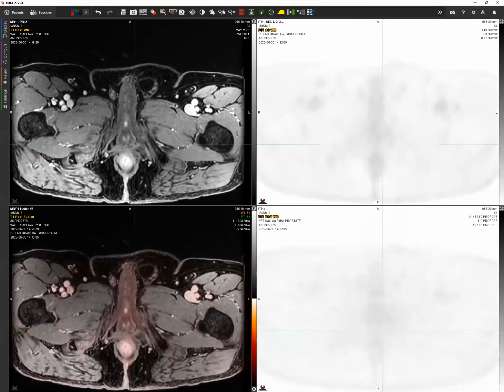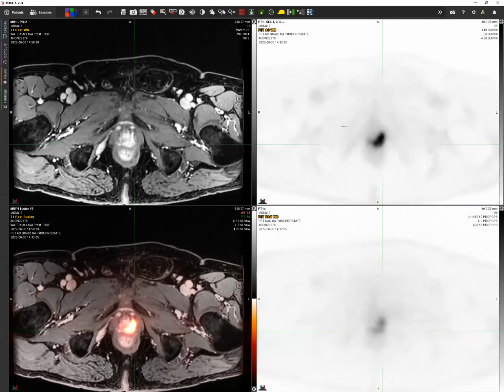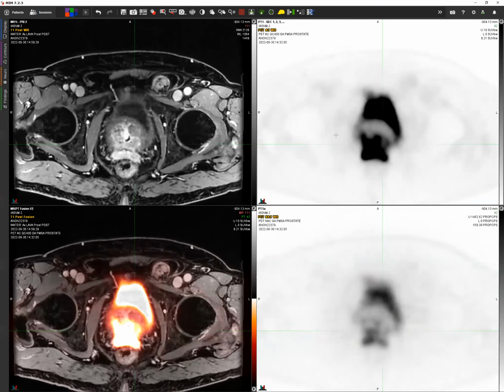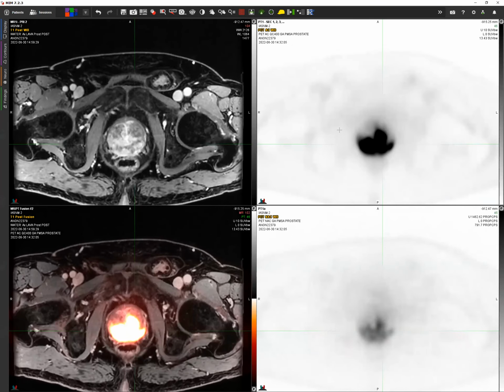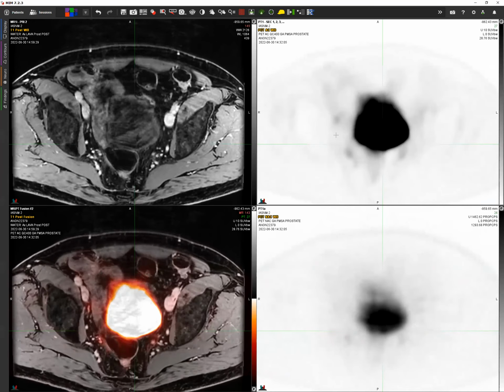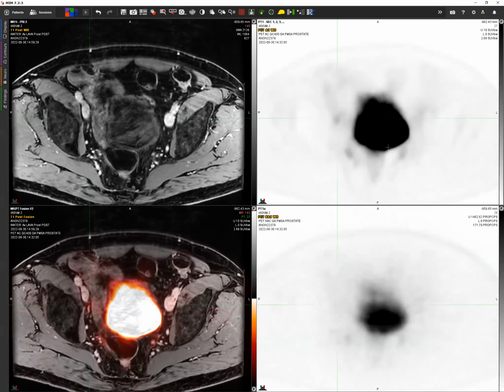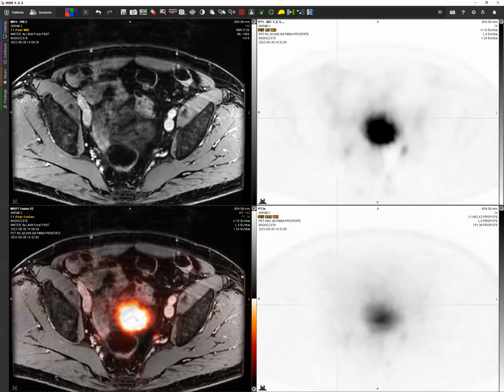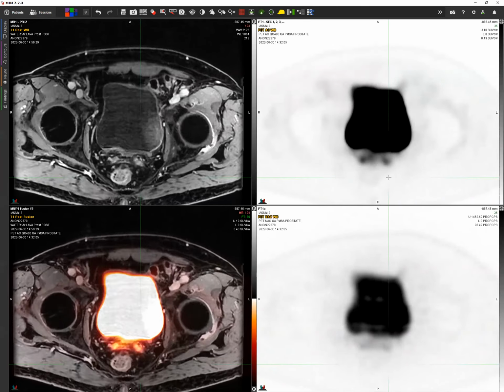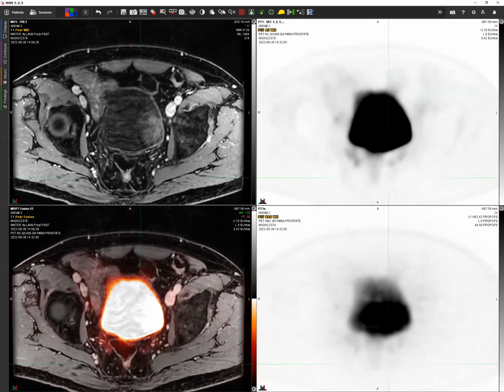Just to give a sample of our image quality at the focused region. So this is our T1 post whole body high res. You can see it fuses very nicely to the prostate. Very helpful for our recurrent prostate patients who still have a prostate in. And then we can see, actually, there's another node here. And some of these other nodes back here are very tiny, but still can be seen, and they have correlates on the MR. These would never be called by a diagnostic radiologist, ever. Never.